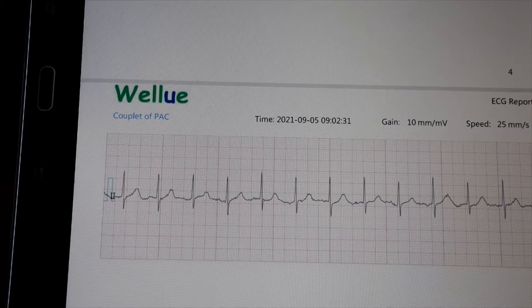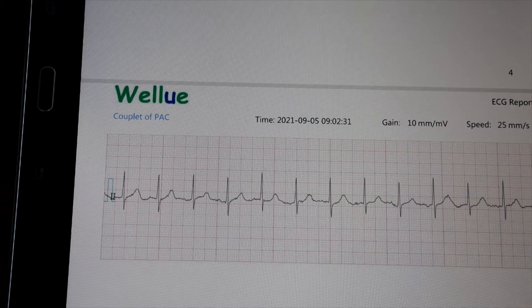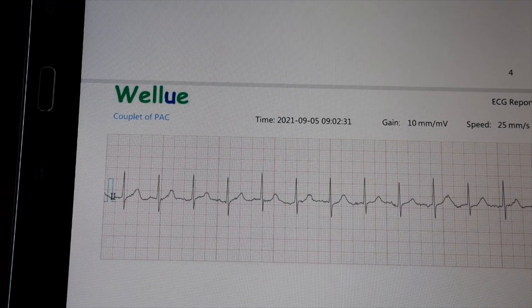I'm definitely happy to have this device because if you have any heart issues like I do, this is critical to your care. Number one, it avoids unnecessary trips to the doctor — I can just send my cardiologist a report and he can determine whether or not I need to come in. It can also catch irregular heartbeats as they happen. In the past, I've waited in emergency rooms and by the time they can get their 12-lead EKG on me, the heart is beating fine. This will catch the irregular heartbeat as it happens because it takes less than a minute to put the strap on and get the monitor going.